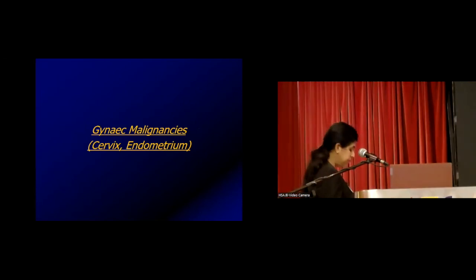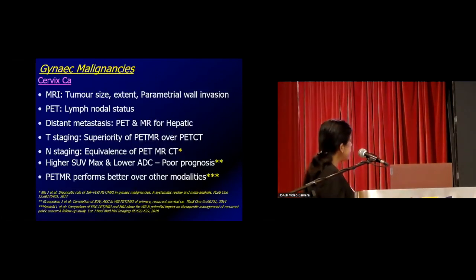So let us move on to the gynae malignancies. Here the MR provides information on the tumor size, extent, and most importantly the parametrial wall invasion. It also gives us information on the lymph nodal and metastatic status. So the PET-MR actually performs better than other imaging modalities as per the literature review.